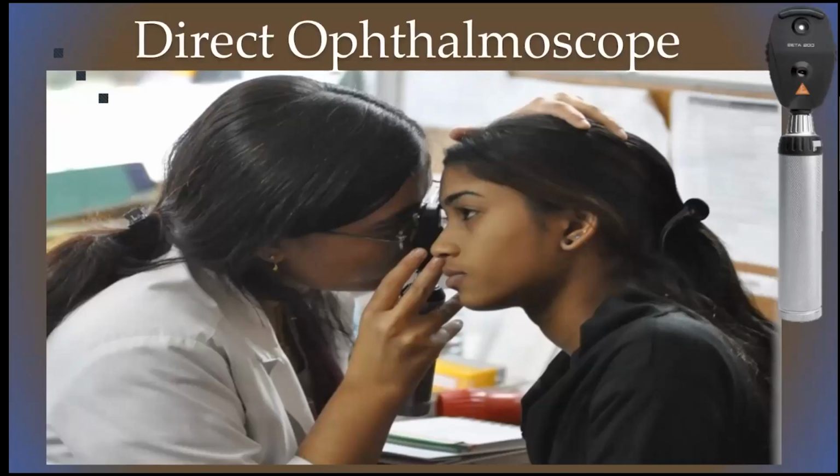So let us move on to the next equipment called the direct ophthalmoscope. It is one of the most important equipment for an ophthalmologist, like a stethoscope to a general doctor. So it is a very important equipment. Whenever the slit lamp is not available, this equipment will help them to look at the fundus and so on. It is also a monocular handheld device.